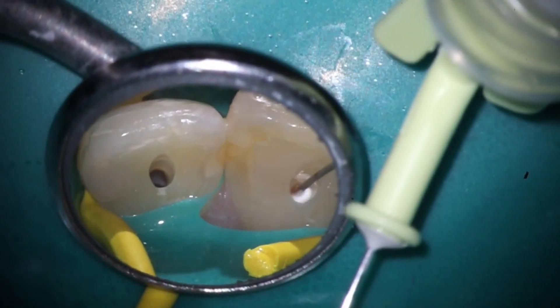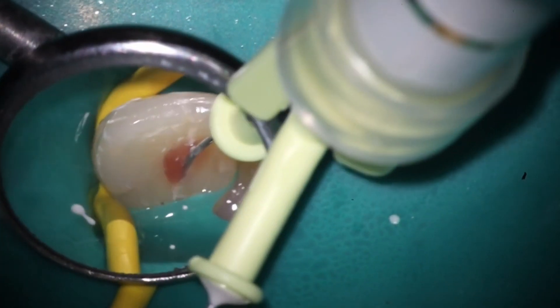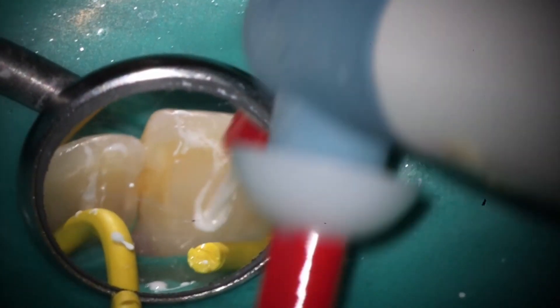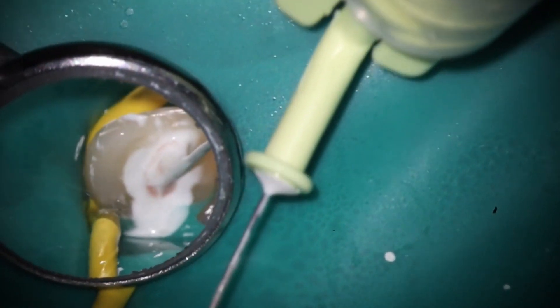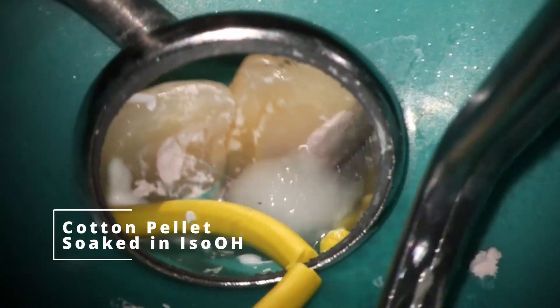I just use the regular stuff from Ultradent with those super small tiny tips. Go inside there. This case was also very long. You can see there's still drainage coming out of that lateral there with the calcium hydroxide. One thing I like to do here is go back in and reactivate the calcium hydroxide as well. The tips on the Ultradent are only 21 millimeters long, and I believe this case was a little bit longer than that. This helps activate it — if you remember back in dental school when you used the little vibrator when you were pouring up models, similar concept where it's going to take something in a paste form.